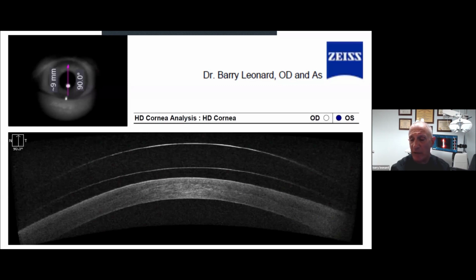And I think back to when I used to try to do these lenses before eaglet, would I ever have gotten to 600 microns of toricity by doing my art, starting out with a couple hundred and adding a little more and a little more and a little more, how good would I have ever gotten? How much would I ever have gotten without knowing what was out there?